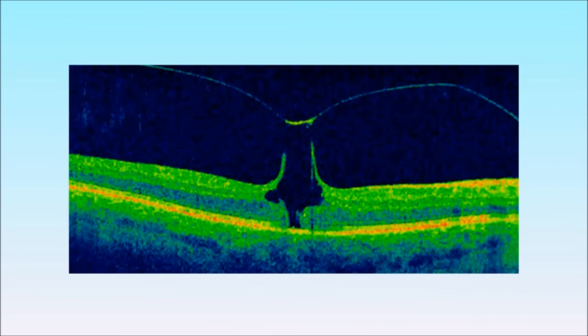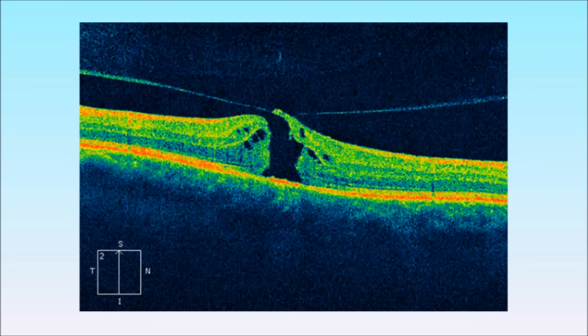In these next two OCT scans the vitreous has moved forward further still taking part of the retina with it. This is called a macular hole and results in very poor vision. It is possible to treat vitromacular traction surgically to prevent macular hole formation.